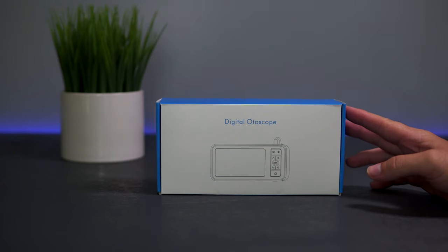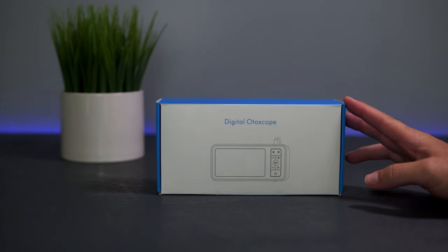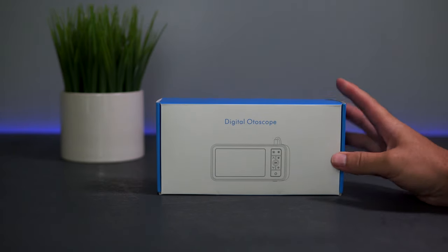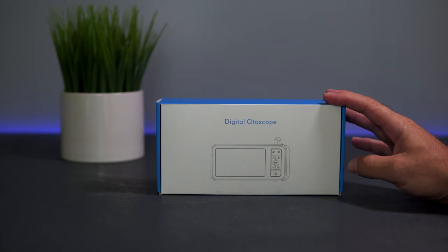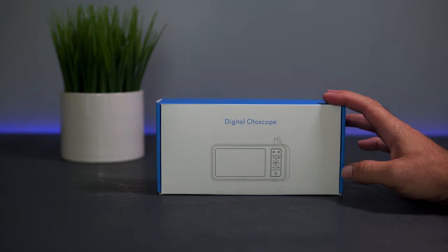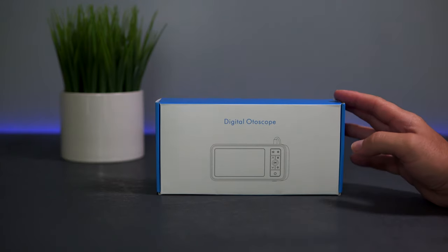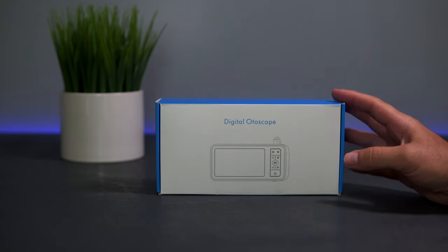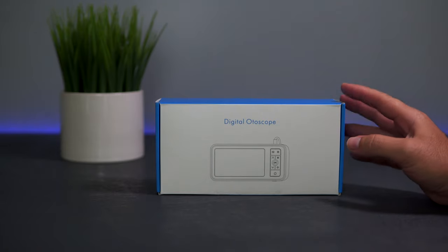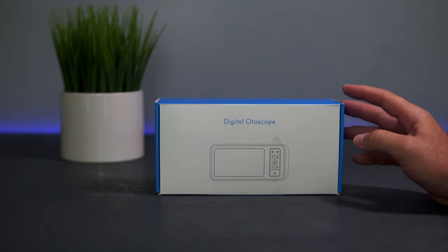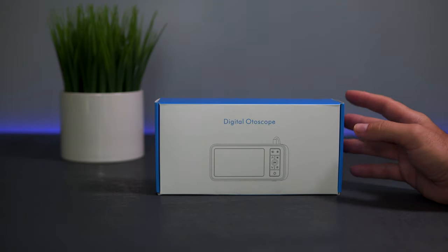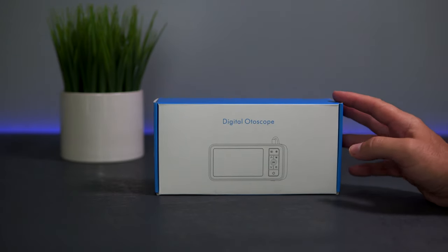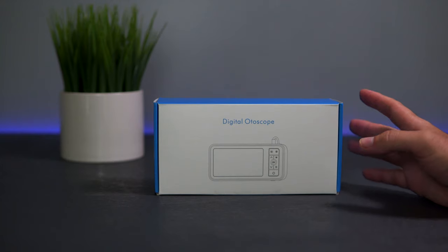Hey guys, welcome back to another video. Today we're going to be checking out a digital otoscope. What makes this thing pretty special is that it comes with its own screen, which makes it a lot more convenient than having to connect it to your phone or fiddling around with wires. This is a more professional way to go, so let's take a closer look.